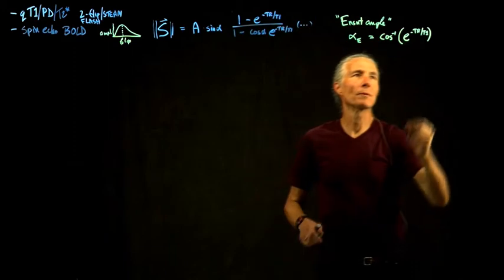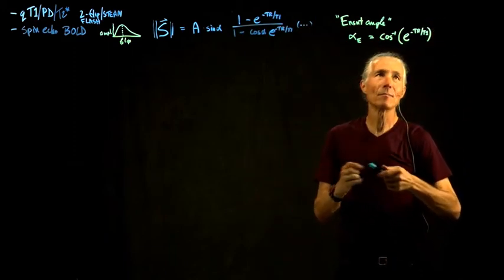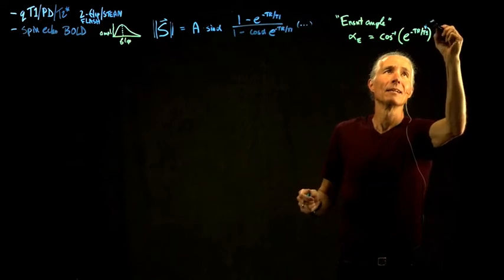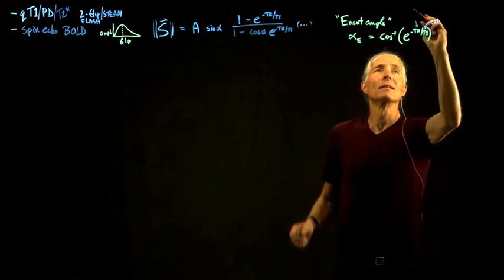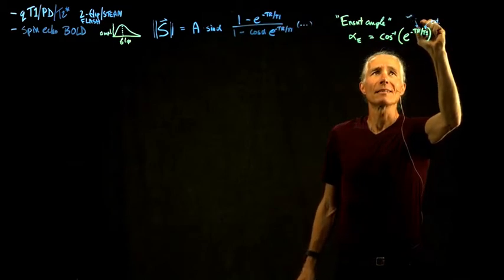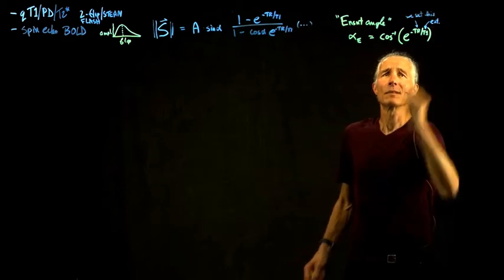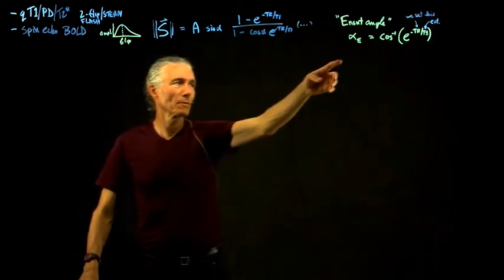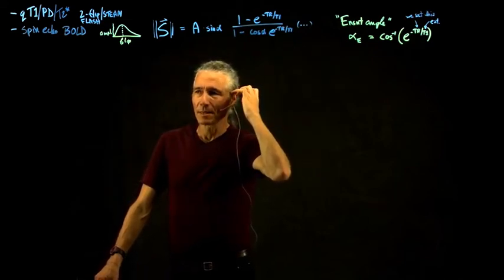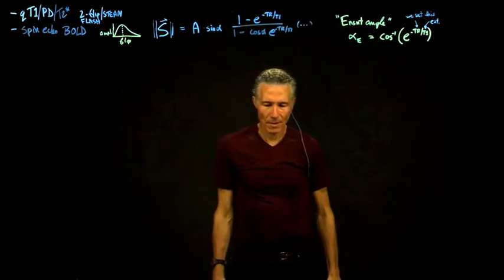So you would have to estimate this T1, and if we set this to 1.2 seconds, what is the flip angle going to be that will give us the maximum signal?